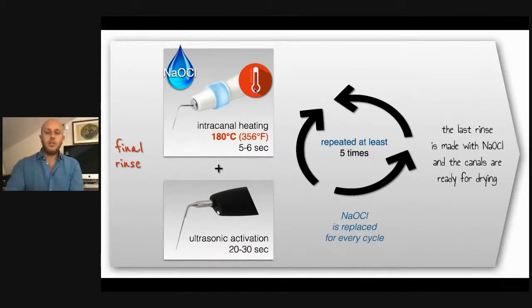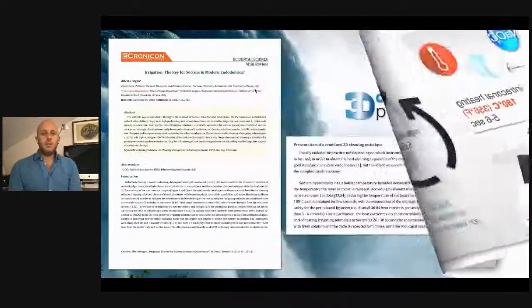Then I replace new sodium hypochlorite and I repeat the intracanal heating and ultrasonic activation 5-6 times until I'm sure to have done the best cleaning and disinfection possible. After that, I'm ready to dry the canals and to do the final obturation of the endodontic space.